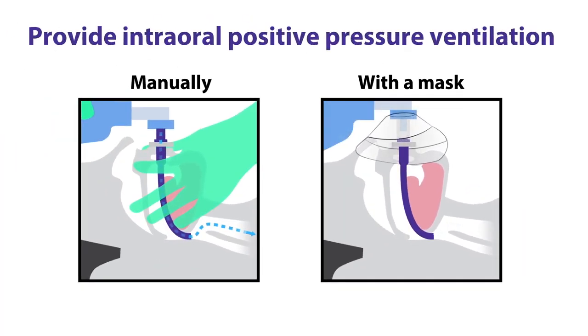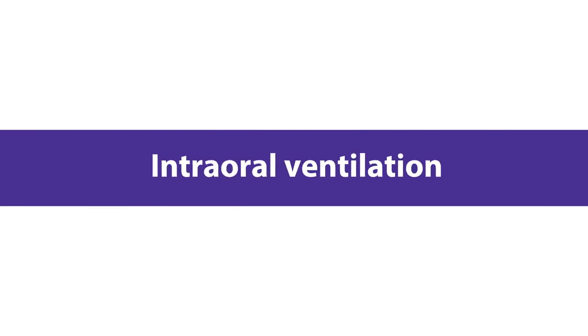Third, to facilitate intraoral ventilation, or IOV, clinicians have the option of doing so manually or with a mask. Let's take a closer look at how the MEA is used with intraoral ventilation.